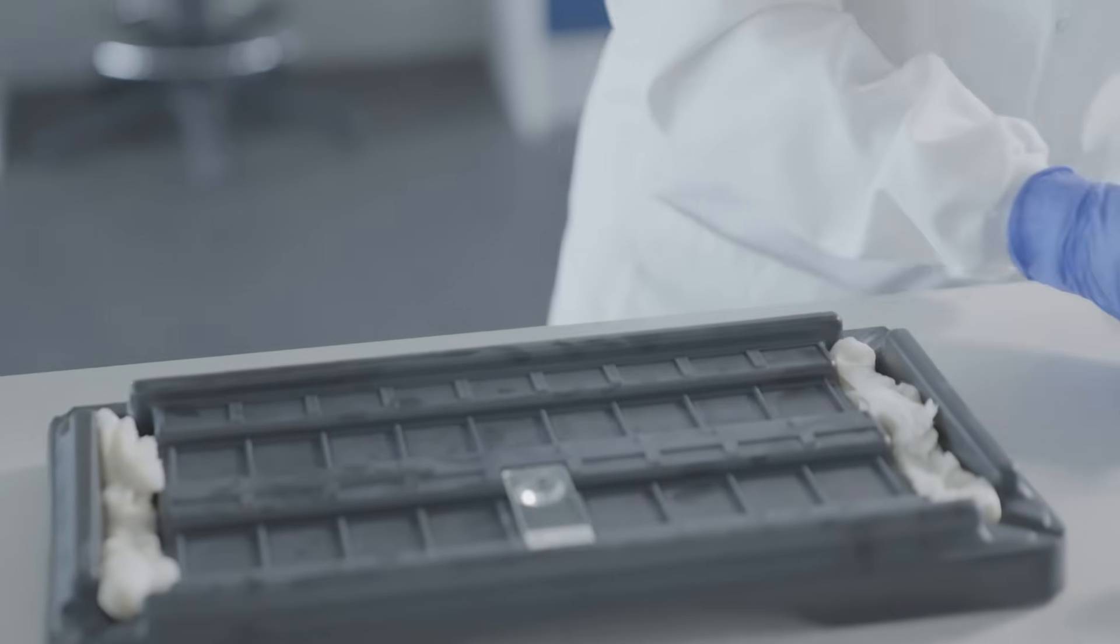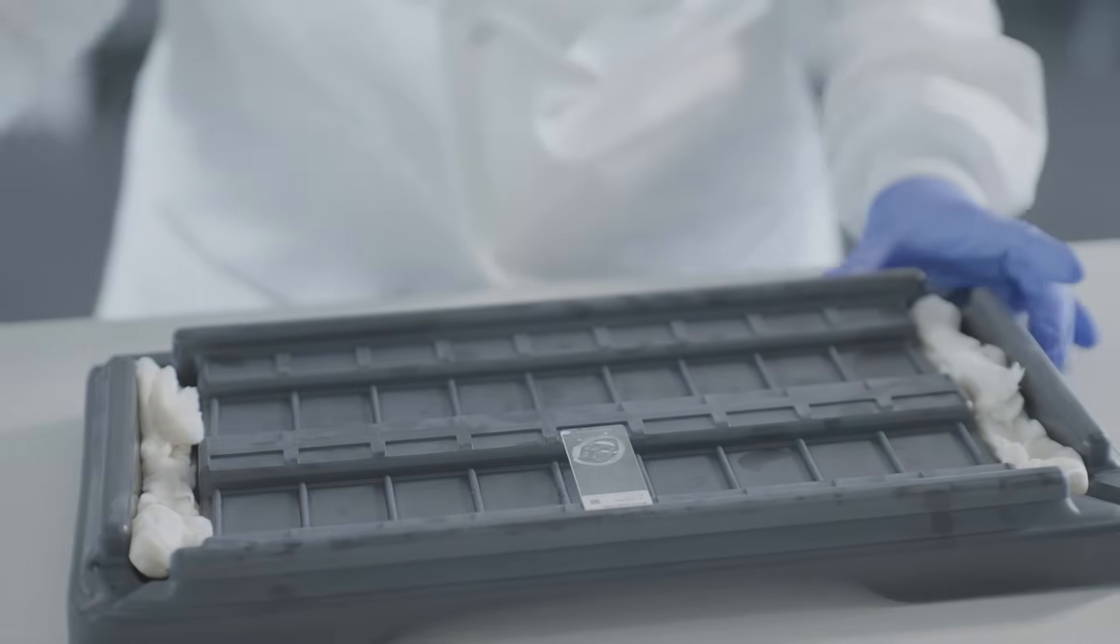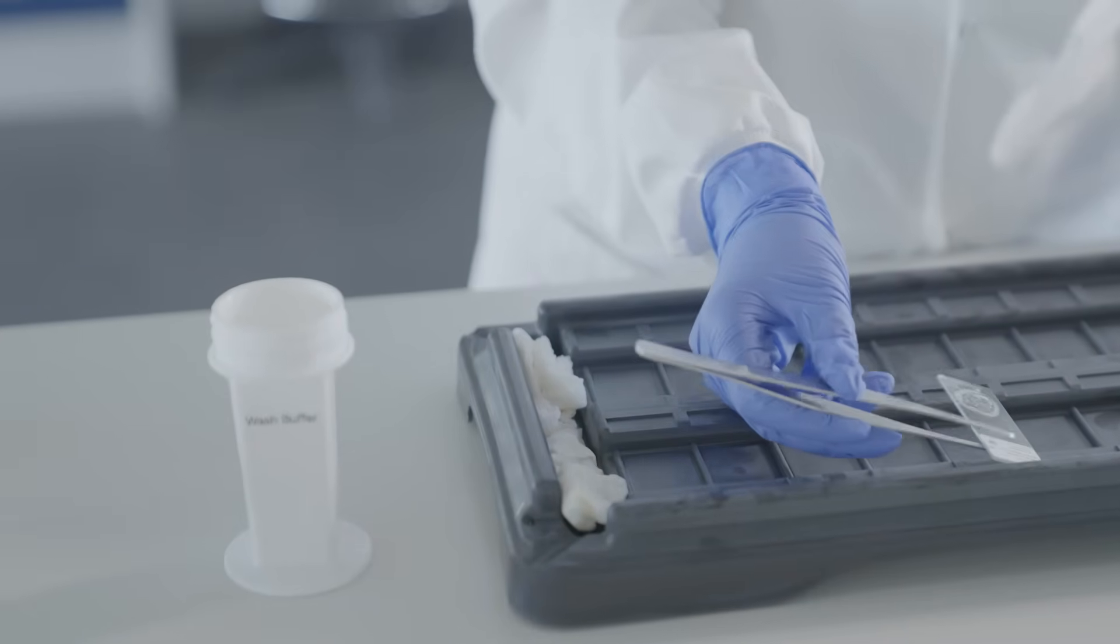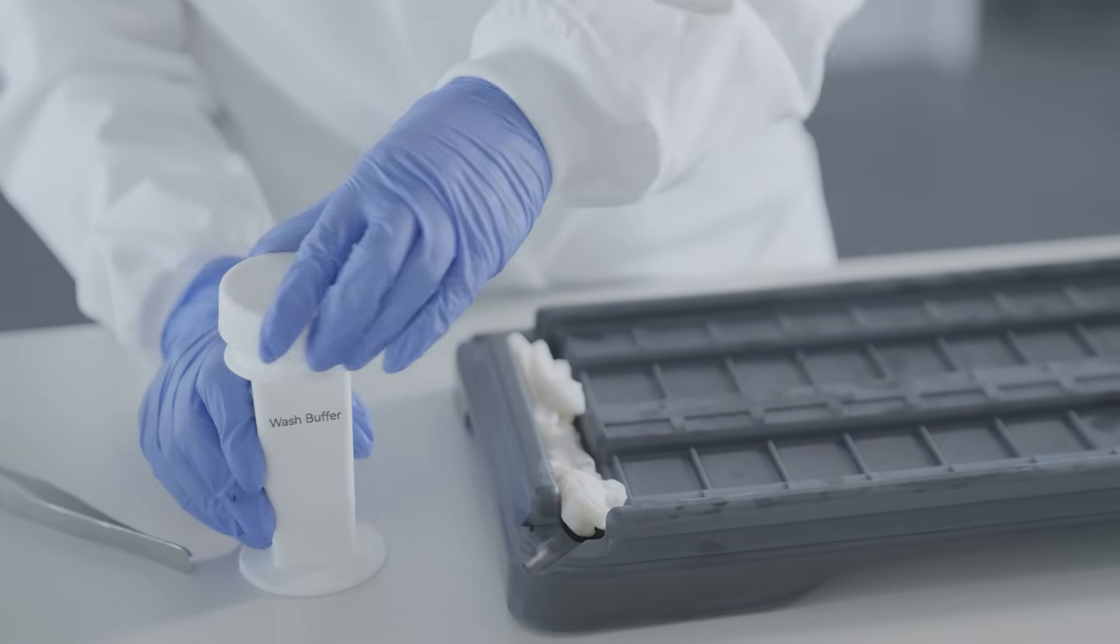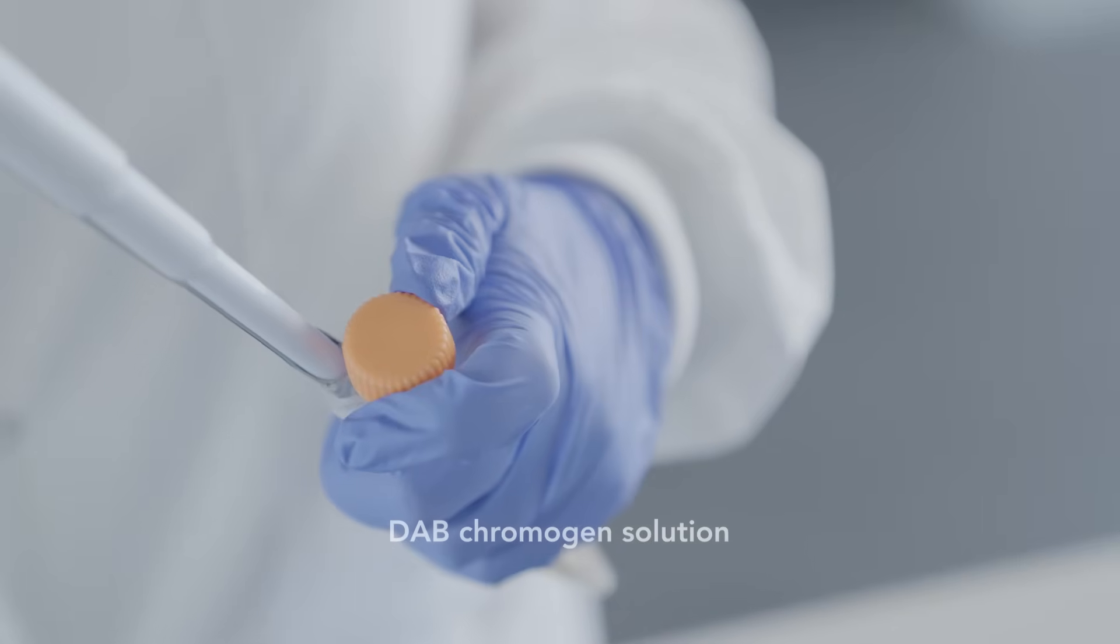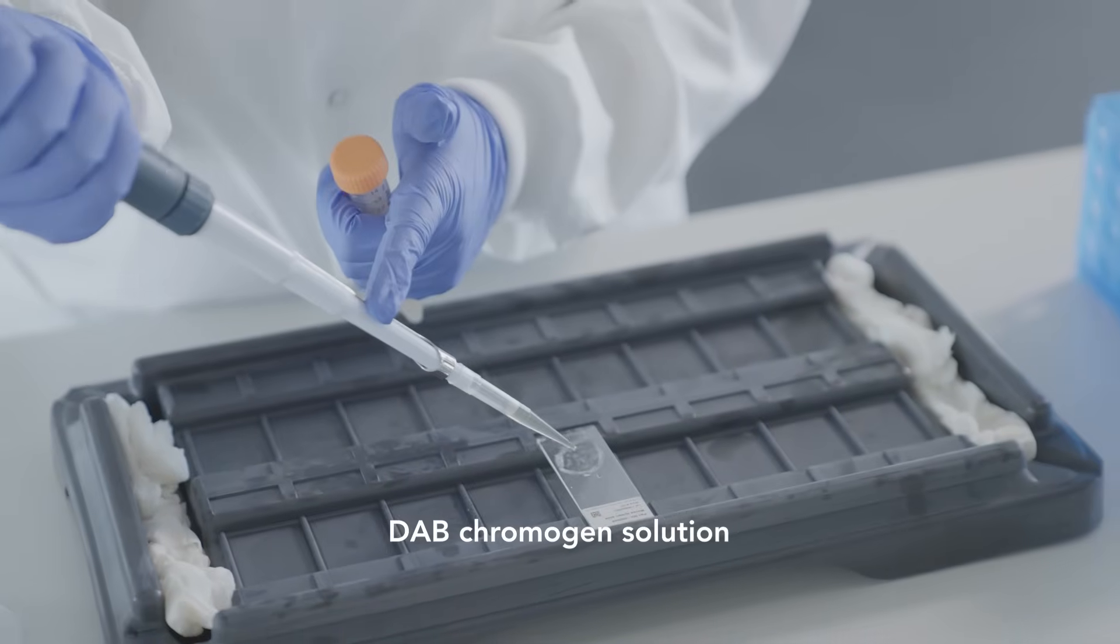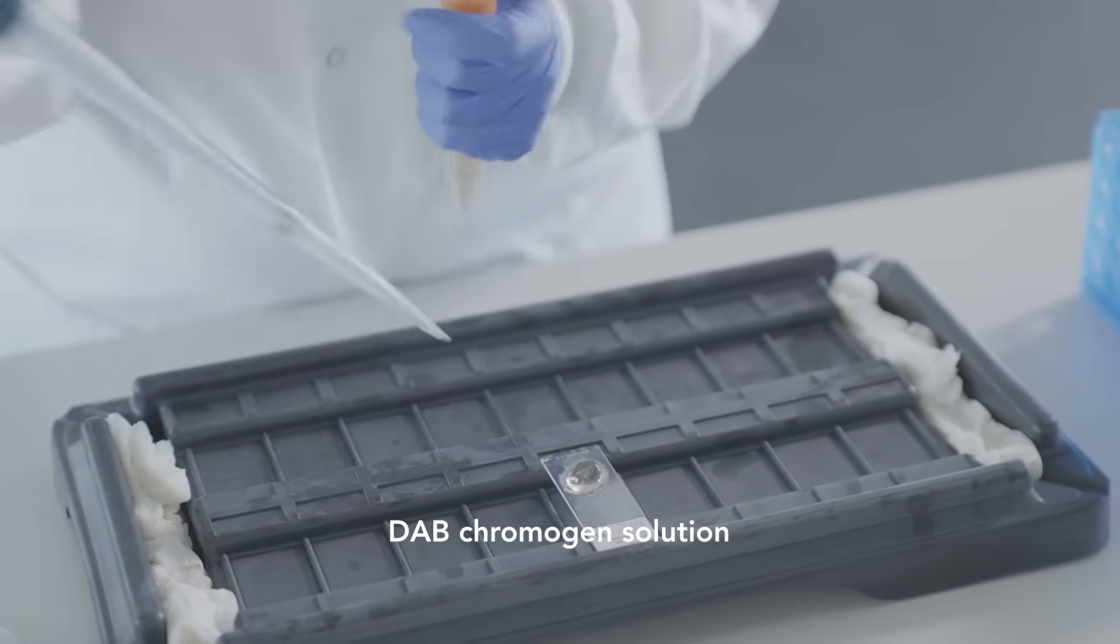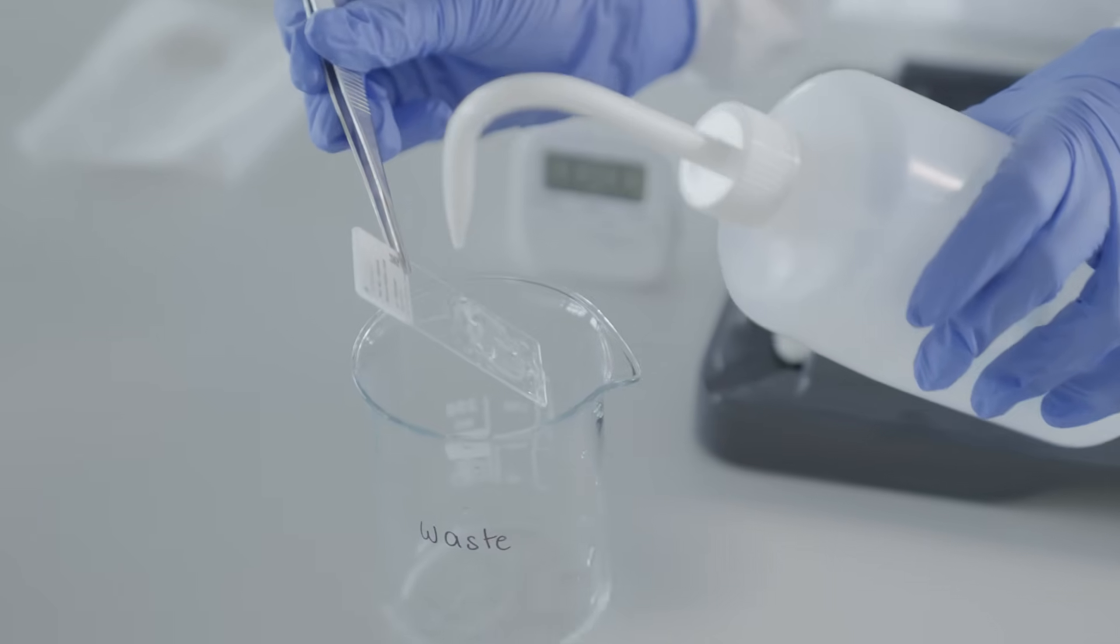Wash slides three times with wash buffer for three minutes each. Prepare an appropriate volume of the DAB chromogen solution based on the manufacturer's guidelines. Apply the substrate carefully and incubate for five to ten minutes until a brown color develops. Rinse sections gently with distilled water.